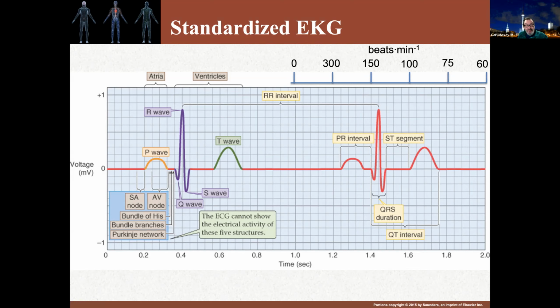This wave therefore represents the journey of an electrical impulse generated by the SA node towards the moment when it reaches the right atrium, and it spans towards the left atrium via Bachmann's bundle. This impulse in the P wave is ultimately what's going to cause all of the myocardium to contract.